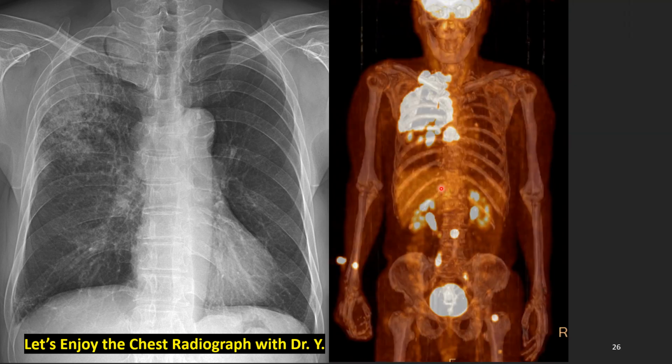What do we see? This is another incredible imaging finding of this patient. Huge, very strong, very large uptake here. All mass, all lymph node metastasis. Are they all? No, we have more. What do we see? Two hot uptakes in the left femur. Bone metastasis. This may be spine metastasis or just in the ureter. I don't know. Anyway, a huge mass with bone metastasis.